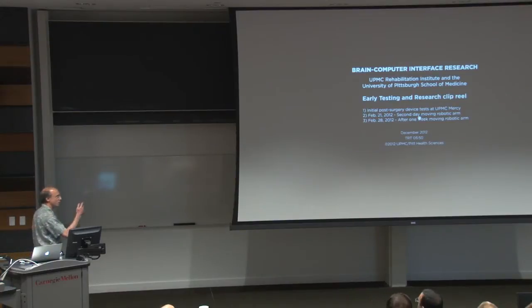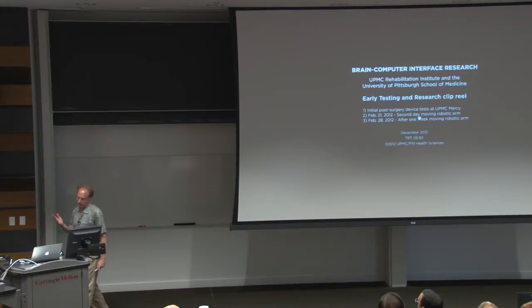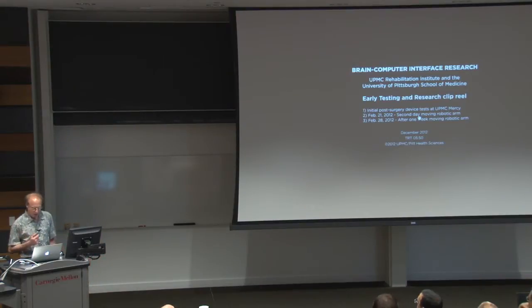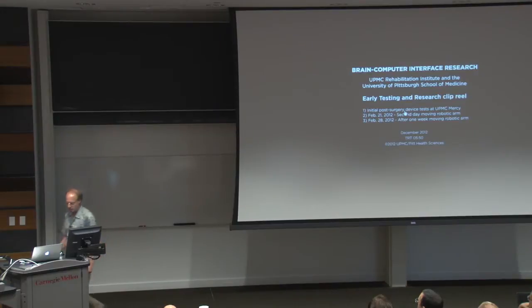We implanted 2 arrays, just like I showed you. And we let her rest a couple days after the surgery, but while she was still in the hospital, we couldn't wait. We brought our recording amplifiers in, and we hooked them up to see what we have, and I'll show you what we got the very beginning.